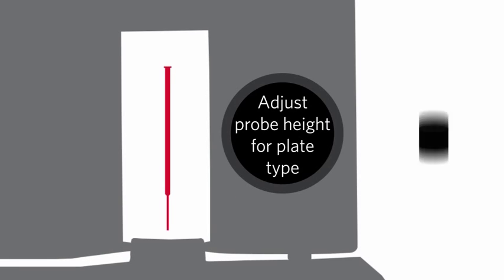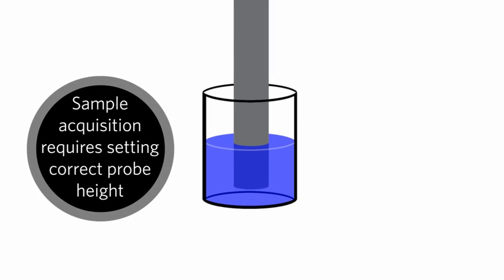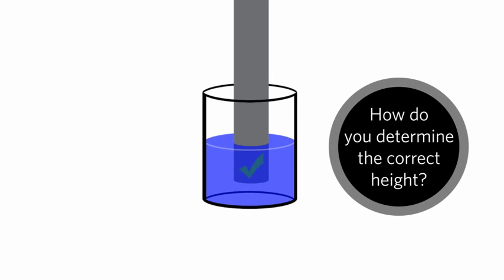Next, adjust the probe height for the type of plate being used. Having the correct height for the probe is crucial for proper sample acquisition. If the probe is set too high, you might get bubbles. But if it is too low, you may not get enough sample. So how do you know what is the correct height for the sample probe?